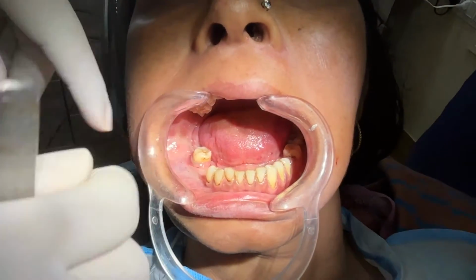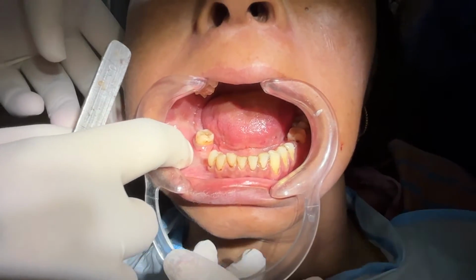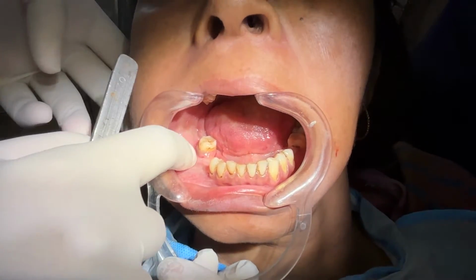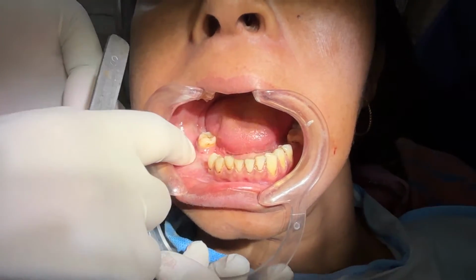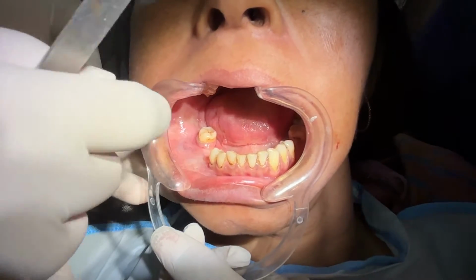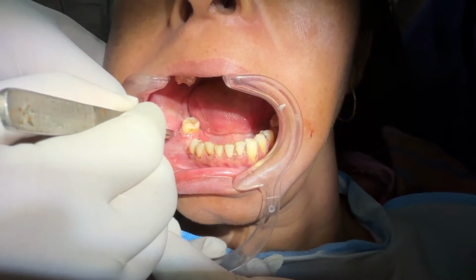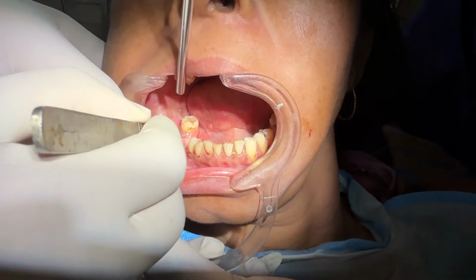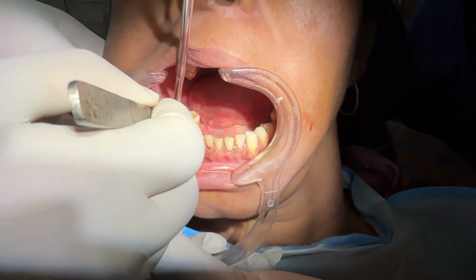So this is the area I will palpate. Now before giving the incision, I have to keep in mind what vital structures are there. Here there is no significant vital structure, only the mental nerve, which is below here, near the lower 5. So I will remain posterior to it. I will give the incision here like this.